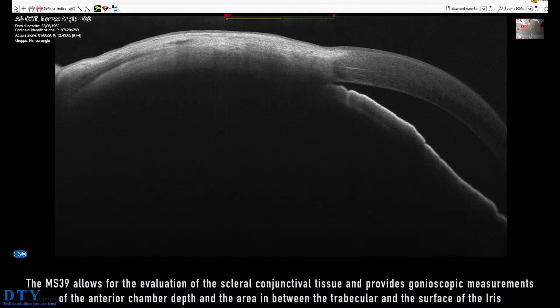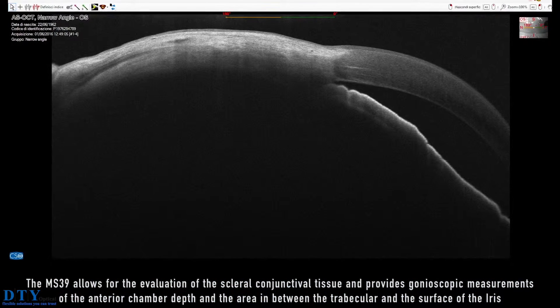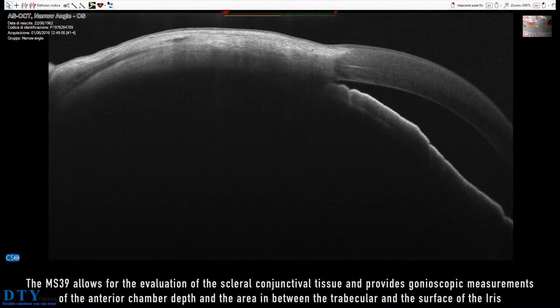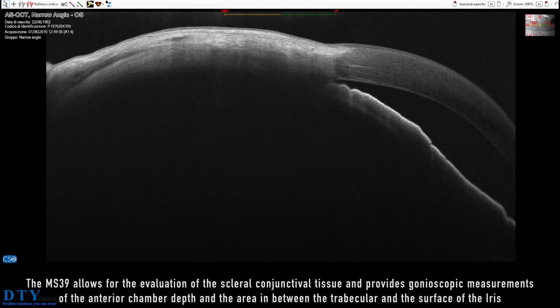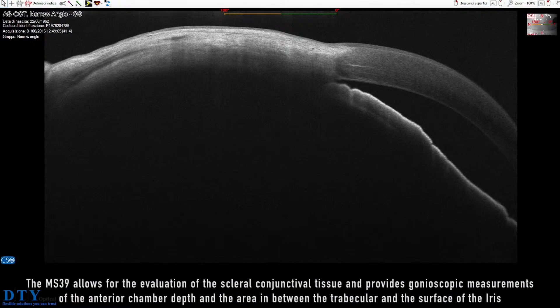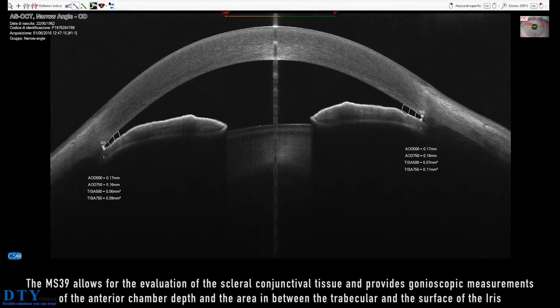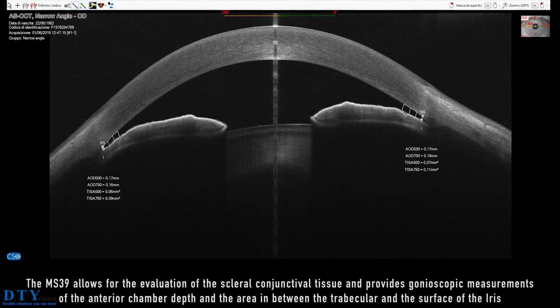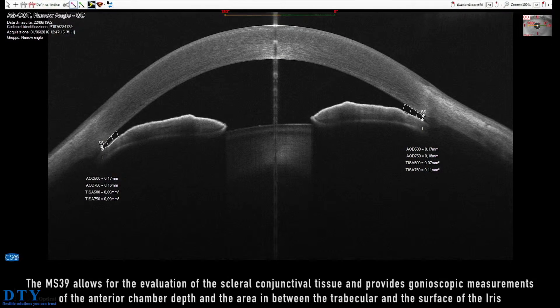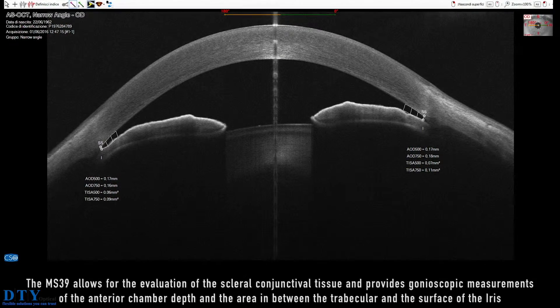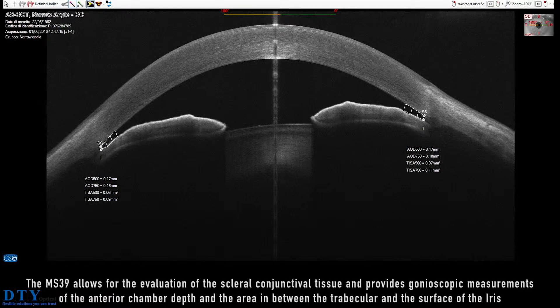MS-39 allows for the evaluation of the scleroconjunctival tissue and provides gonioscopic measurements of the anterior chamber depth and the area in between the trabecular and the surface of the iris.